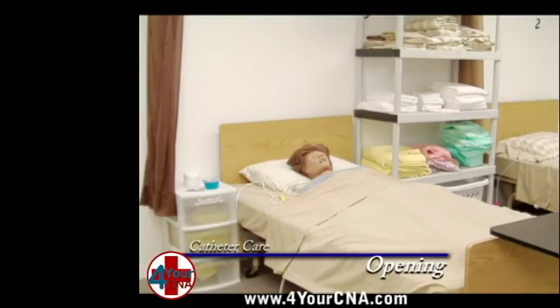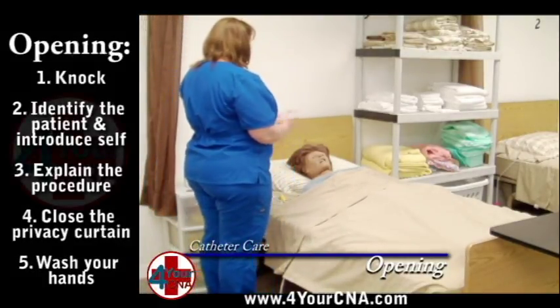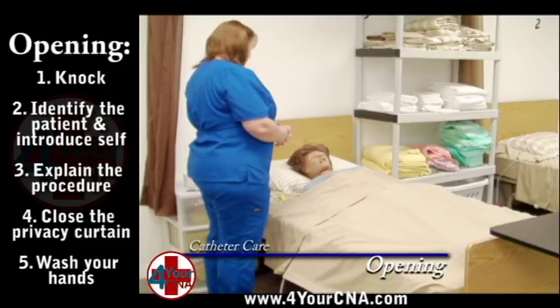This skill will be performed on the mannequin. Knock and identify your patient, introduce yourself by name and title, describe what you will be doing, and obtain permission.